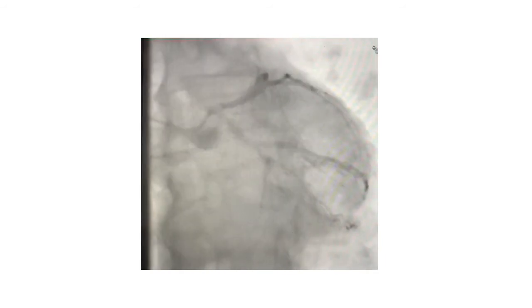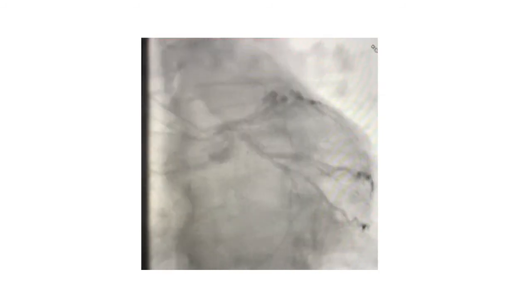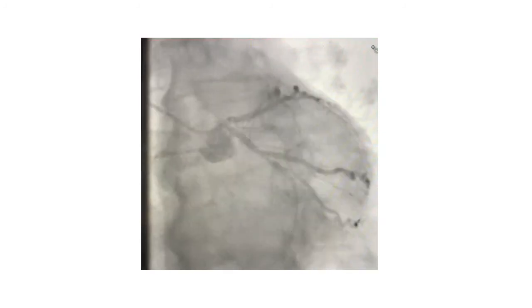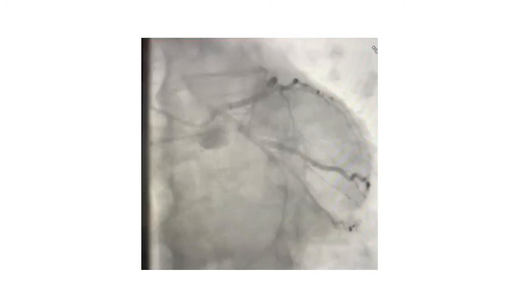The vessel running beneath is the circumflex and its OM branches. And the vessel that runs above it and is somewhat foreshortened is the LAD. Remember again, as we said before, that the apex is very anterior. So as you go caudal, the LAD moves above or more anterior to the circumflex. So in caudal views, the LAD is above, the circumflex is below. And you can also again appreciate how the caudal views are better for visualizing the circumflex artery. You can actually see some disease in the branches down there. But looking at the LAD in this view, as you can see above, is not very helpful.